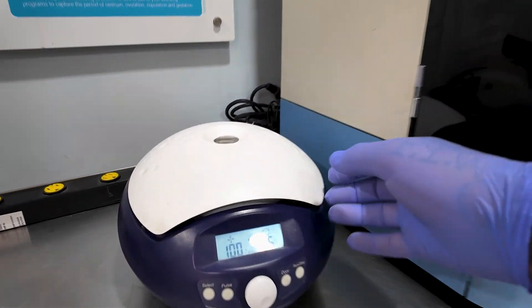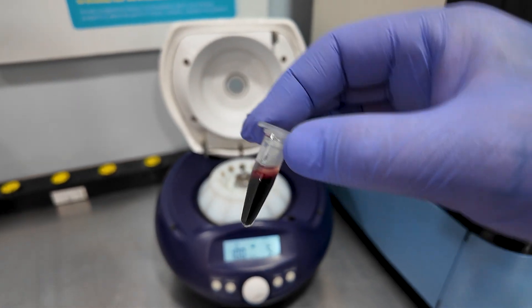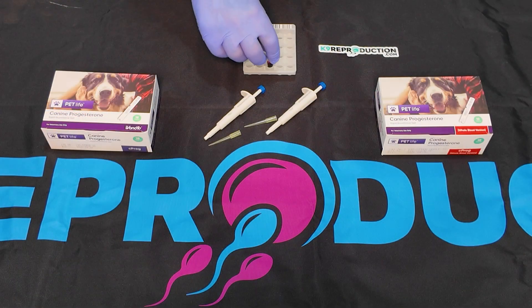Once the blood is spun down, it's important to check the serum for clarity. Any discoloration, such as redness or pinkness, can compromise the accuracy of the results. If this happens, you'll need to perform a new blood draw.